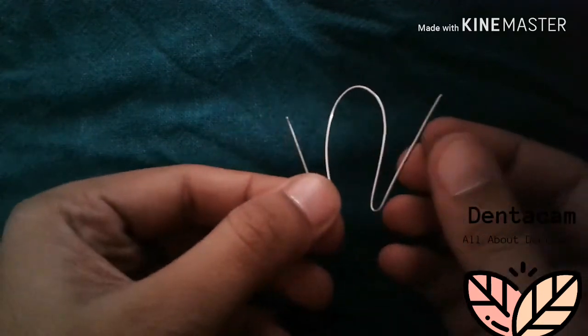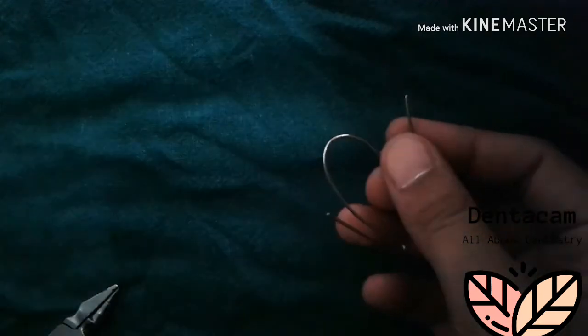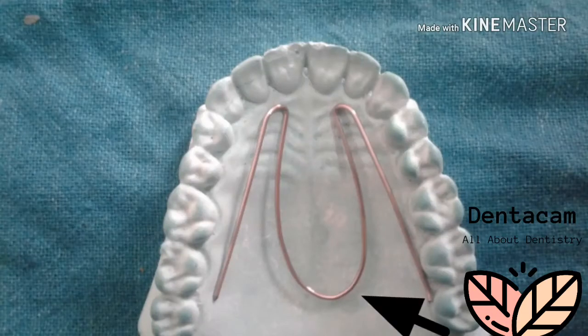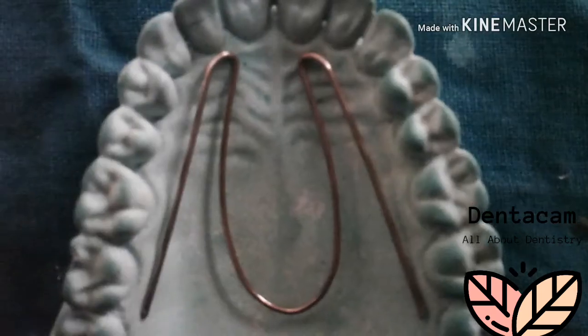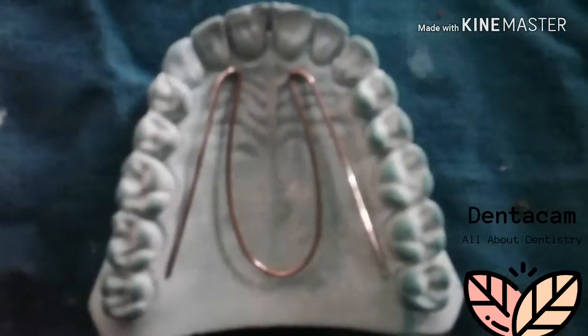Remove the excess wire. This U-shaped wire is placed in the mid-palatine region with the retentive arm incorporated into the base plates. Sit it over the cast and check for adaptation.